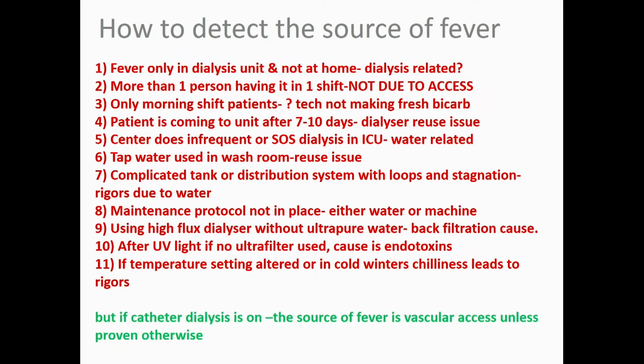Yes, remember, high flux dialyzers used in places where the water treatment is suspect are bound to lead to more fever and rigors due to the back filtration issue. So you need to be careful in centers which do not have an up-to-date system.